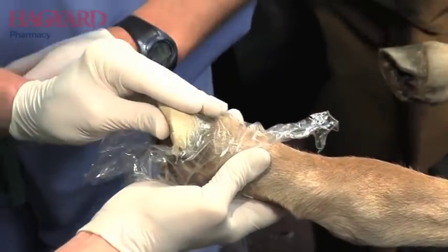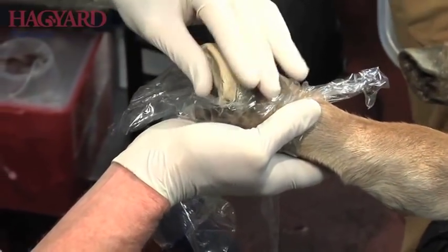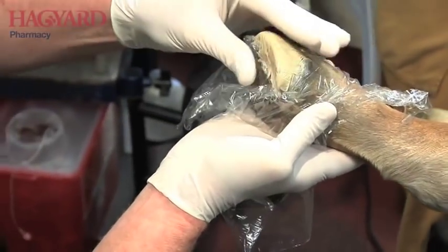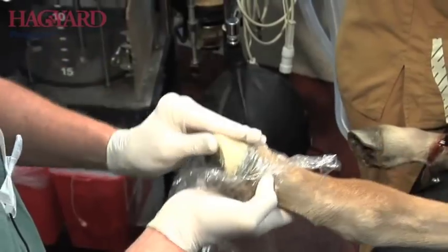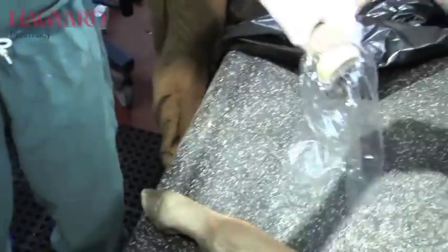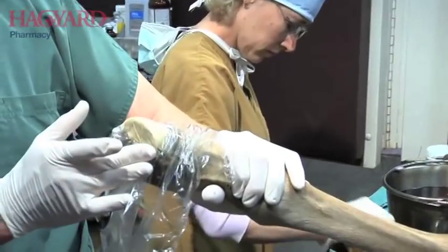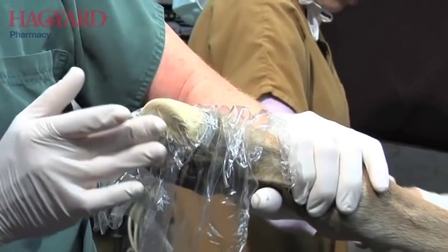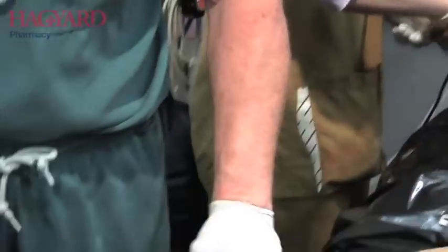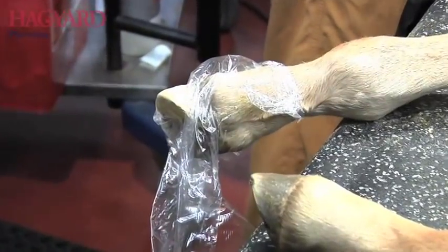We form this material so that it mimics the contour of the bottom of the foot. We can't have any high spots, or that'll cause lameness. It has to conform to the bottom of the sole as well, so that it looks just like an extension of the foot. You can see there that it's symmetrical to the foot — looks kind of like the foot. I don't put a big blob of material underneath it because that causes some soreness occasionally. It's fairly easy and straightforward. Now it'll heat up and we'll cool it off.